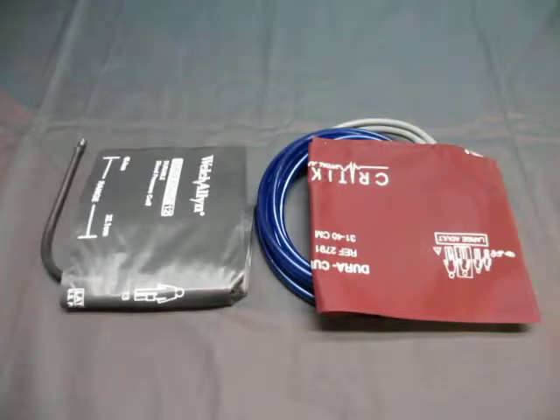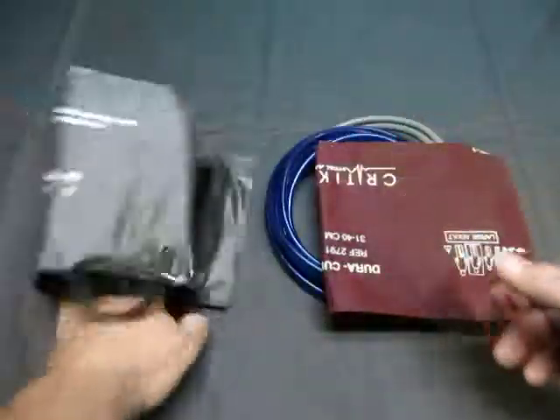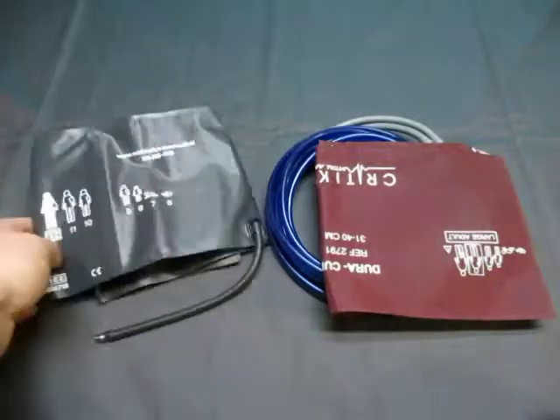Up for auction we have a lot of two blood pressure cuffs and some hose. The first one is a Welch Allen large, 32 to 43 cuff. It's in very good condition — I don't think it's been used that much.